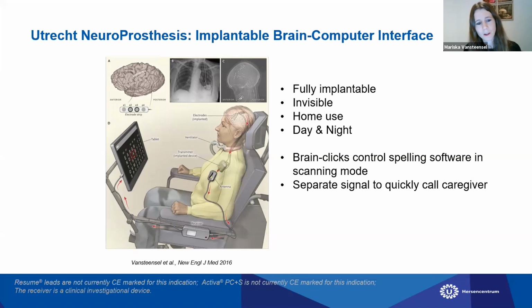And these functionalities are available to the user at their home in their daily life to communicate with their family and caretakers, both during the day and since recently also during the night, and without any required involvement of the research team. So it's basically completely independent of a research setting. It can work without us being needed. And we have learned that this device can, as such, offer a significant contribution to the quality of life of those individuals, of our study participants. And therefore, I think it's good to have this discussion today.